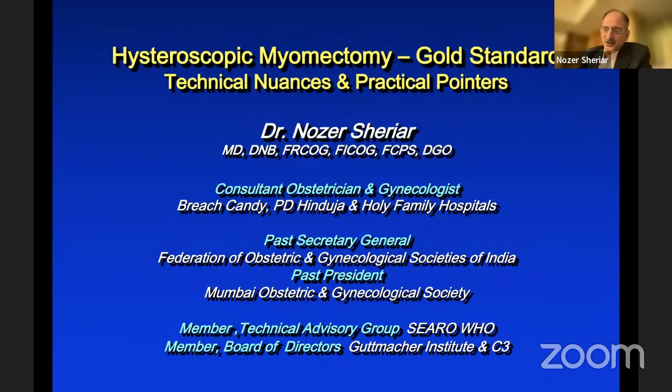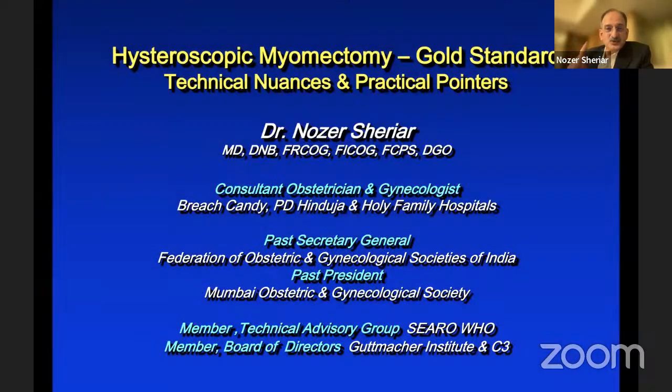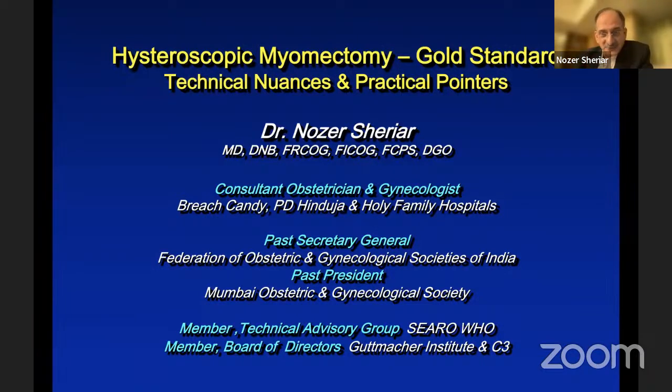I would have had a lot to discuss, but I'll tell you something quite interesting. We were doing outpatient hysteroscopies in Wadia Hospital from 1990 to 93 with a 4mm hysteroscope. Truly outpatient, in the OPD, with no anesthesia. We had video endoscopy. I had a team of infertility officers working with me. I can remember Jaideep Tank and Kedar Ganla, who became so good at it. Just imagine, now you have the better kit. We were doing outpatient hysteroscopies for patients of primary infertility with a paracervical block, with them watching the screen, and we were definitely doing it for other reasons.